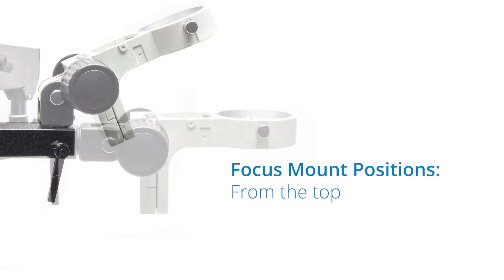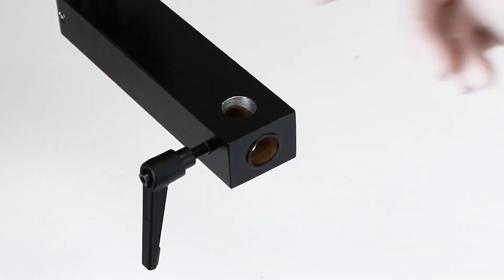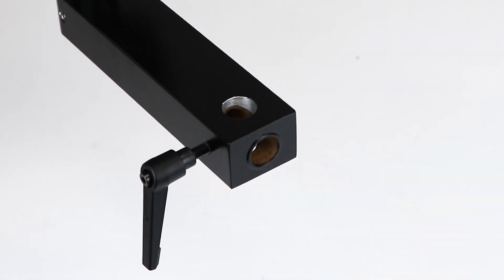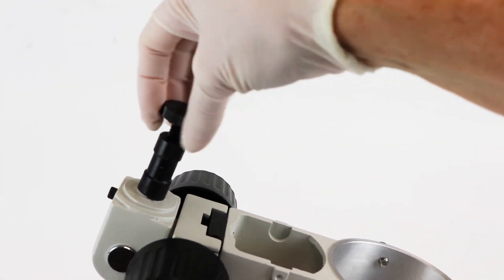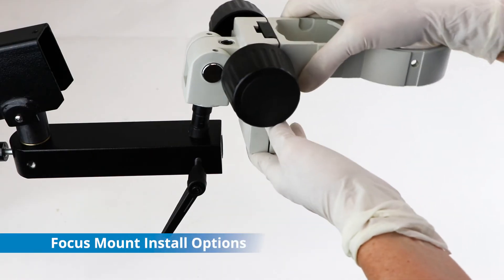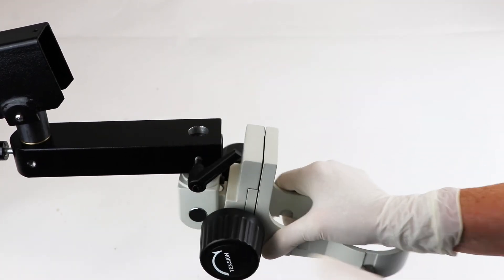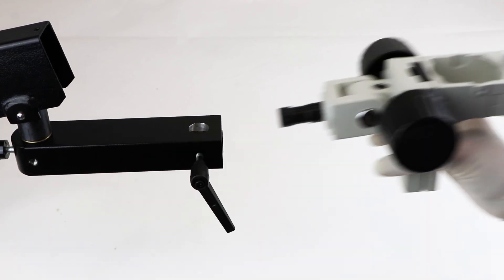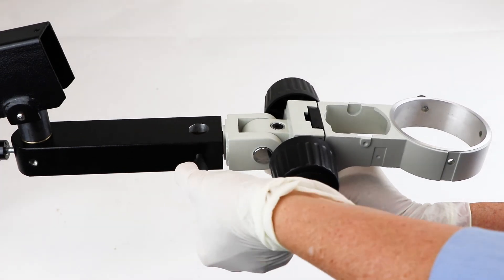A focus mount may be installed on the articulating arm in one of three positions. The small horizontal bar has a vertical hole and a horizontal hole in the end of it for attaching the focus mount. Remove the screw cap from the end of the mounting post on the focus mount. Install the mounting bar through the vertical mounting hole of the small horizontal bar from the top, or from the bottom, or slide the mounting bar into the horizontal mounting hole in the end of the small horizontal bar.